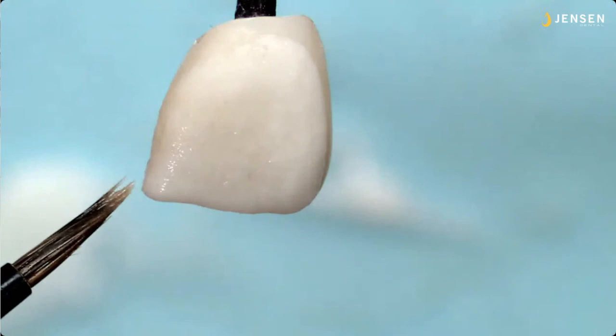And what you're going to do is wipe it on the towel 2 or 3 times like you're stropping a razor, and that will clean out that brush. That's the only thing I've really seen that cleans the lint out of those brushes. You can't even see the lint, but when you wipe it across the crown, you will see it afterwards, because the crown, this structure material, is very sticky and it'll grab any kind of dirt.